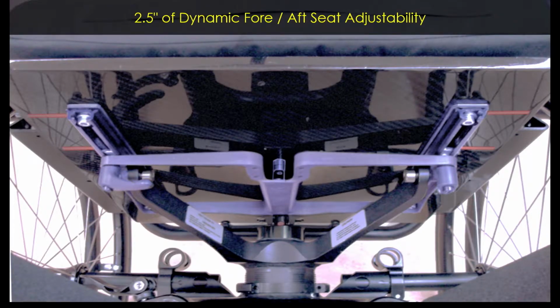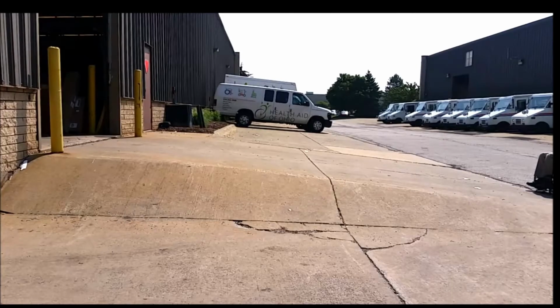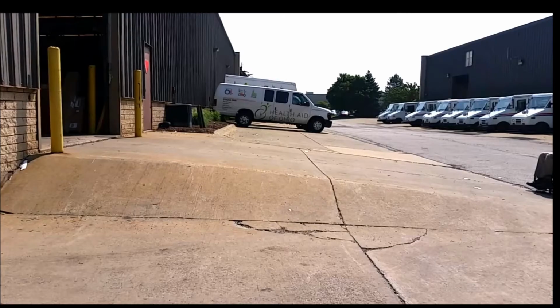It was never designed to be used with quick release knobs so you could actually do that when you're in the chair. So you had the ability to slide the seat forward and backward, which is really no different than moving the rear axle forward or backward. So I could basically make it as tippy as my chair, but if I move that seat forward 2.5 inches, that would move my center of mass forward over the front casters. And you can see the difference here.